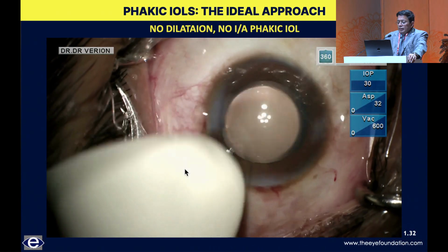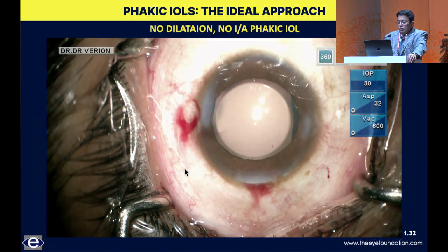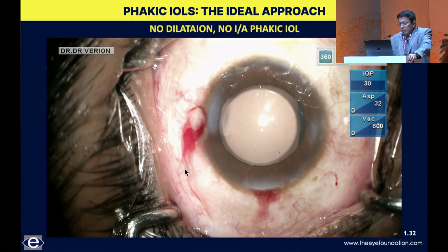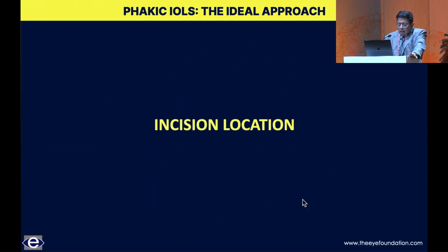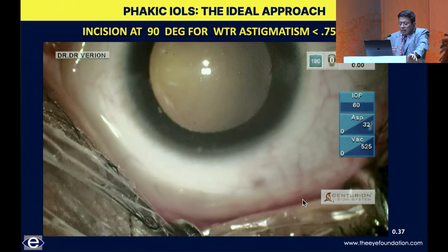Whenever there's a toric intraocular lens, which is almost 75% of my cases, a Verion overlay is used. It's hardly an edited video, and as you can see, it just takes about a minute and a half for me to complete the case. If bilateral implantation is needed, we go on to the next eye with a completely different set of instruments, a separate nurse coming in, and I also change my gloves and my apron before starting the next surgery.